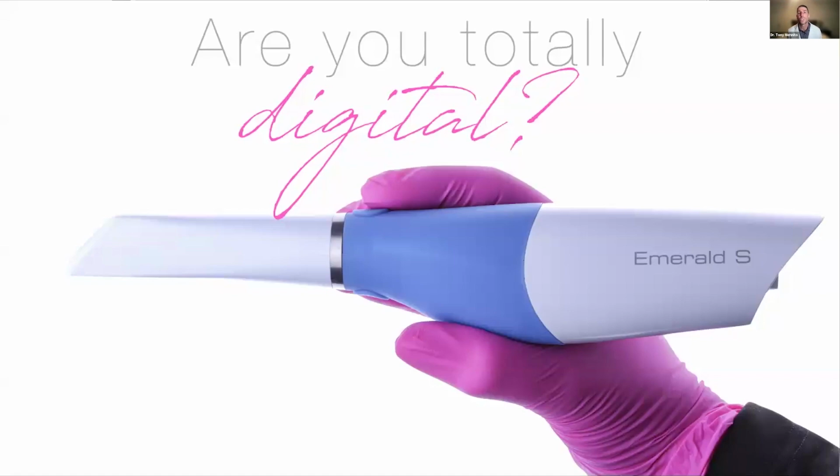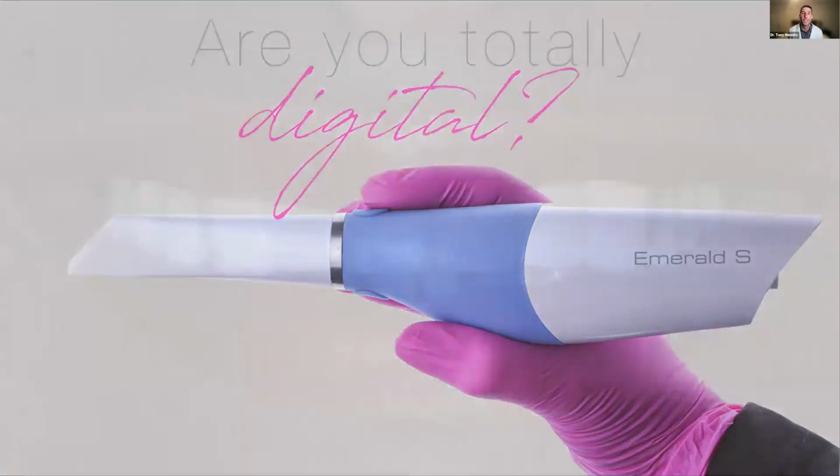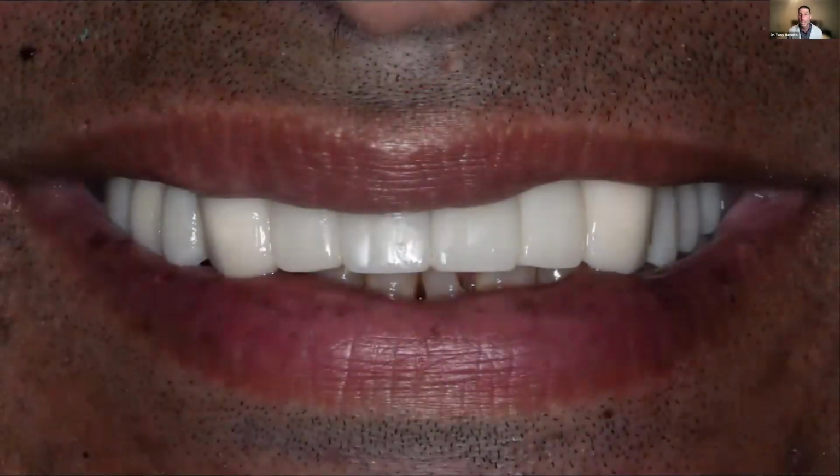So in a totally digital practice, having a printer makes a lot of sense, because sometimes you need a physical thing, a physical model, to do some really simple workflows. We make a lot of Essix retainers, we make a lot of whitening trays and things like that. So we print a lot of models in our practice. So that's one thing that I really love. The other thing is, this is a problem solver for me.